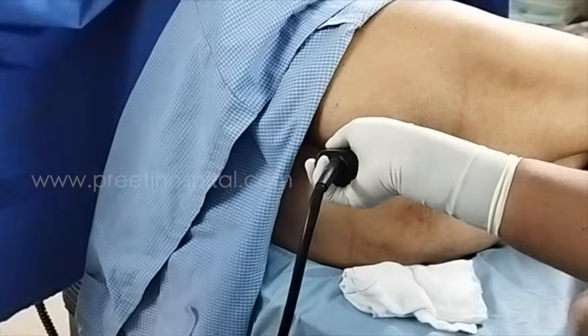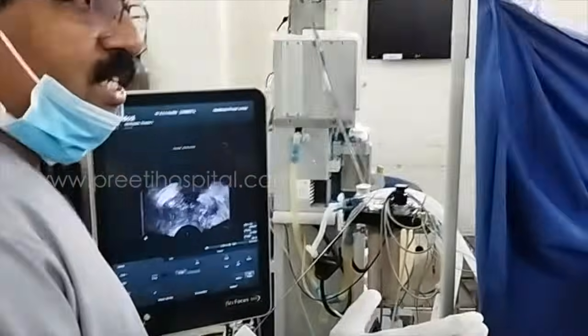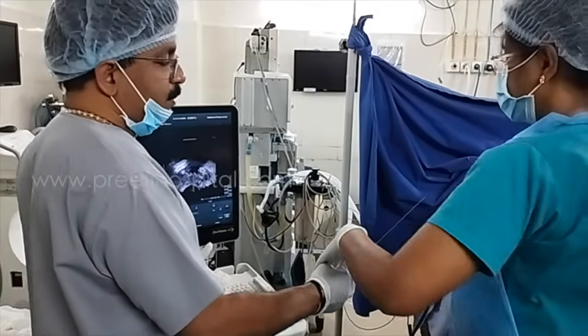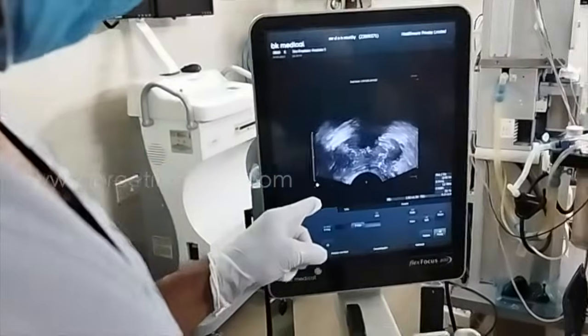One is left lateral sagittal, left medial sagittal, and left center axial. Middle part of the base part of the prostate, because the base part is the one which is shown. Now you are in which position? Now I am showing the left gland.